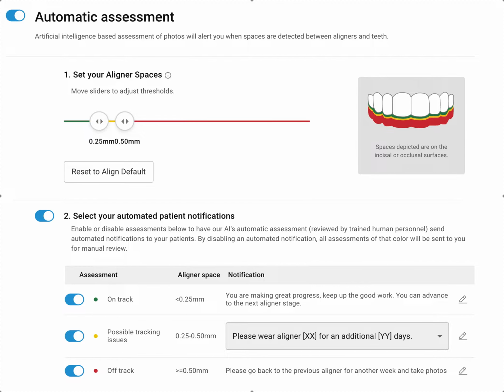All right, moving on. So about a month ago, or maybe more, they released an AI version. I'm kind of meh on it. I gotta give this disclaimer.